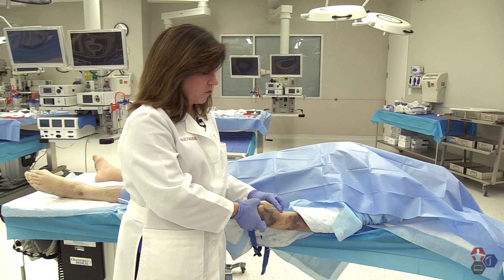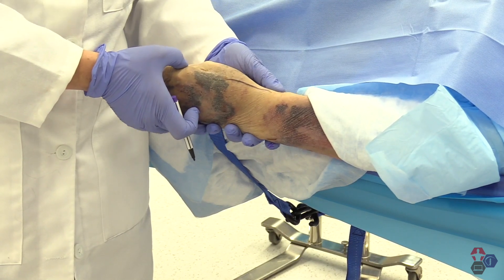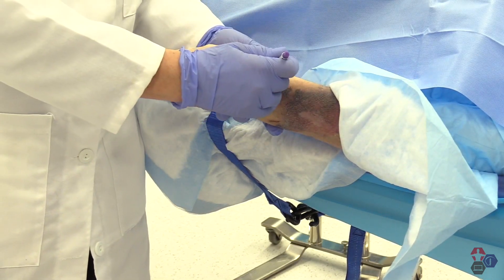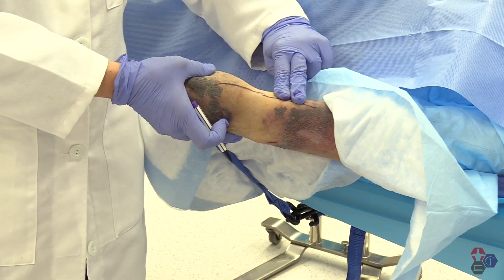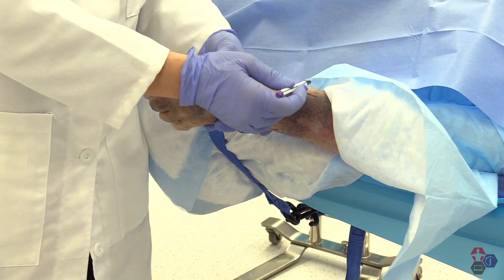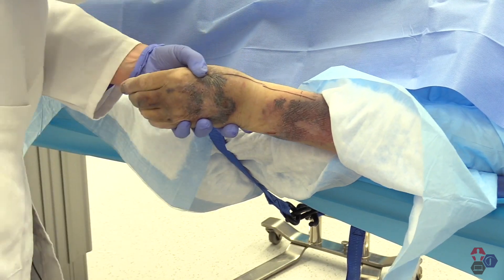My landmarks for the superficial radial nerve are the anatomical snuff box, the radial styloid, and I always want to palpate my radial artery. I want to go dorsal to that and two finger breadths above the radial styloid. I believe this nerve trunk is right about in this location, and I'm going to lay down my wheel of anesthetic in that location.